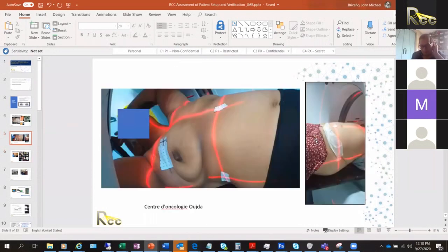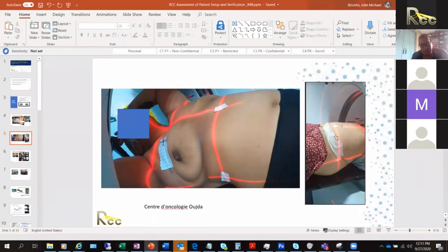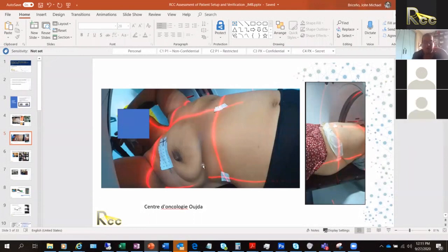This is a great way to set up breasts for simulation. Sometimes, people use breast cups for patients with large breasts — similar to the belly problem, you don't know where the breast will be. Depending on the roll of the patient, the breasts might lay more anteriorly. So some people use breast cups in order to secure the breast position and ensure reproducibility.